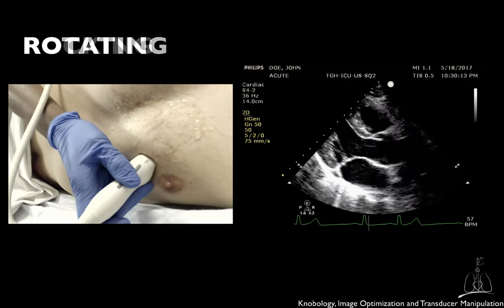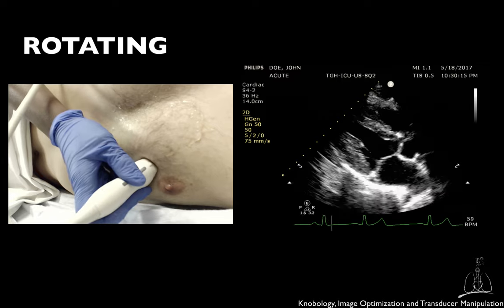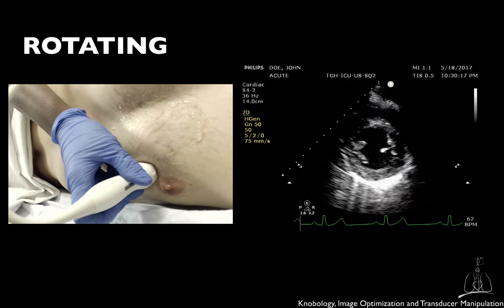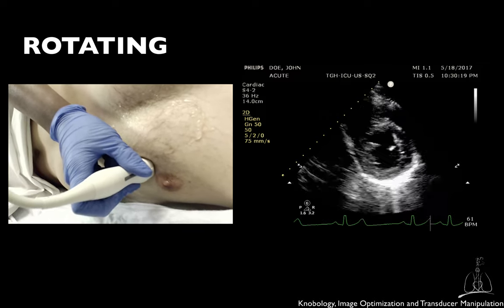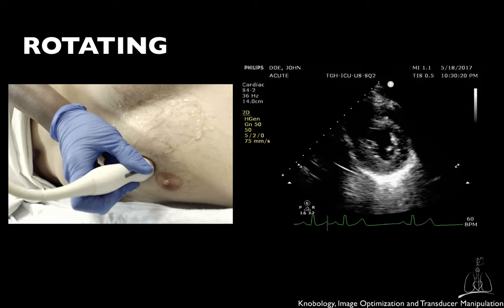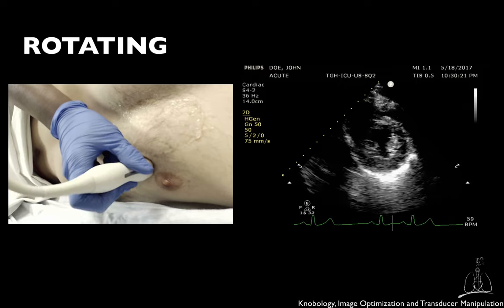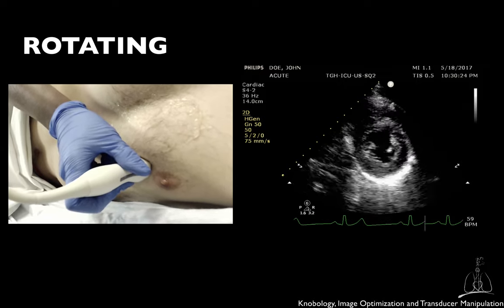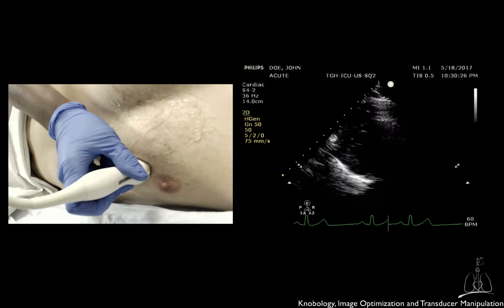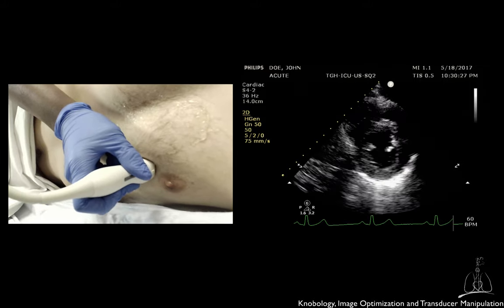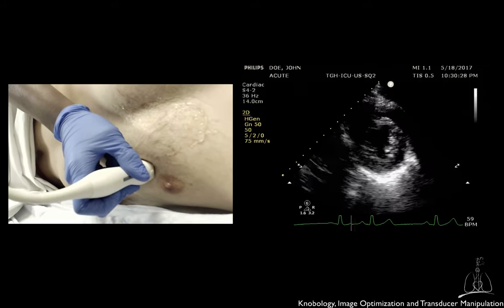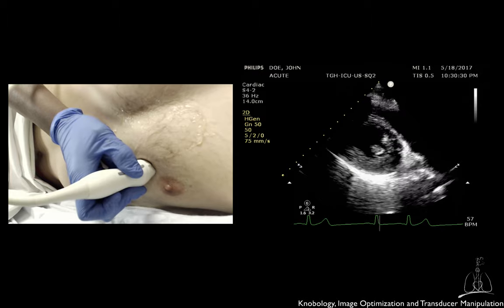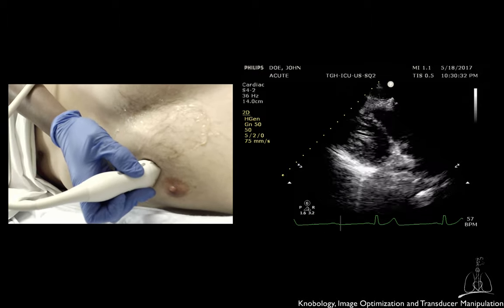Finally, a clockwise 90-degree rotation will change the view from long axis to short axis. Especially at the beginning of your training, we recommend you to do only one manipulation at a time. To better understand which movement modified your view, remember that a very small movement of the transducer will lead to a significant change in a deeper scanning plane.